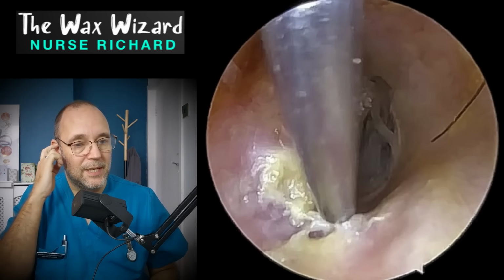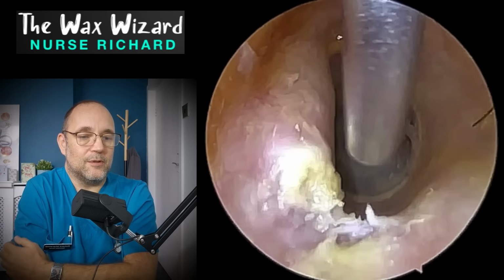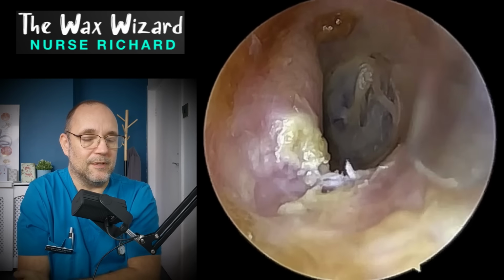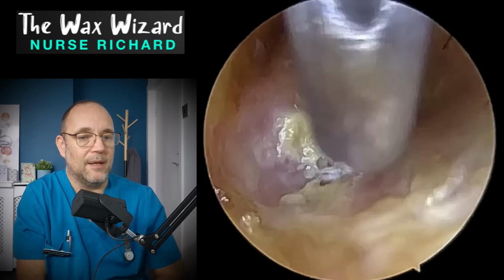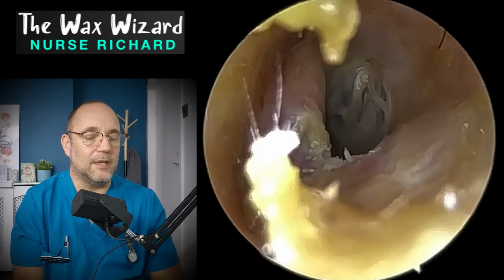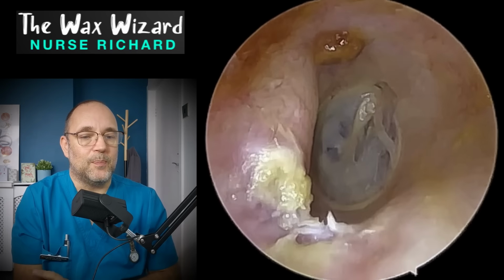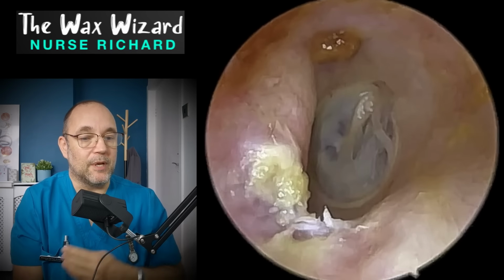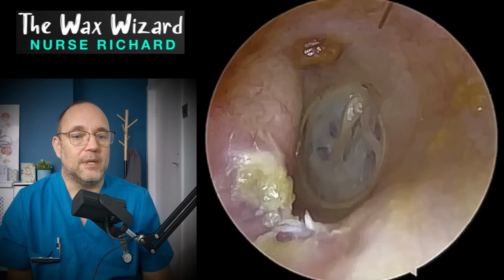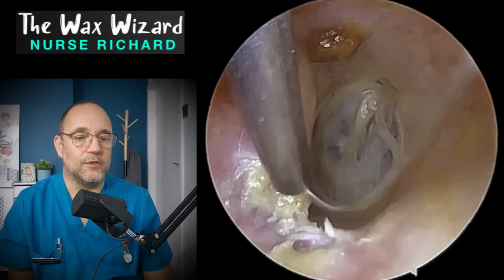Now, what's the cause of this here? So yes, it is mushy. There may well be some exposed bone. It's really difficult to make out though, because that yellowish area there, I'm not entirely convinced that that is exposed bone itself. I think it's more likely to be a softened plug of dead skin, keratin. I wasn't fully able to remove that because she did find it quite uncomfortable, unfortunately. So there does come a point where you have to stop and say, okay, enough is enough. We've found a problem here and now let's refer it onwards.